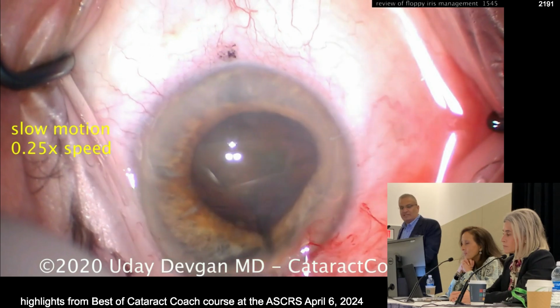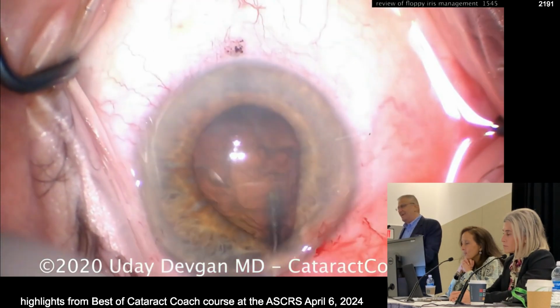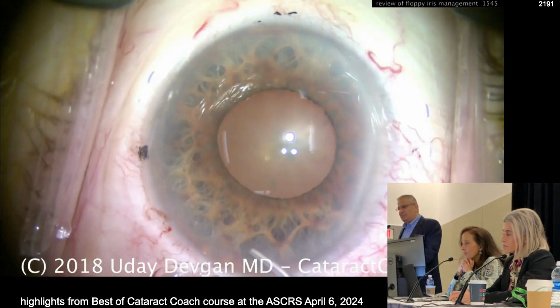But now, of course, for the rest of the case, this iris is going to be very mad at me, and this pupil is going to come down now. So now, this pupil will punish me.